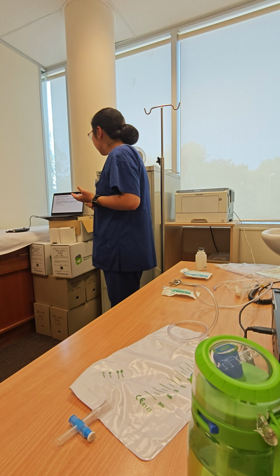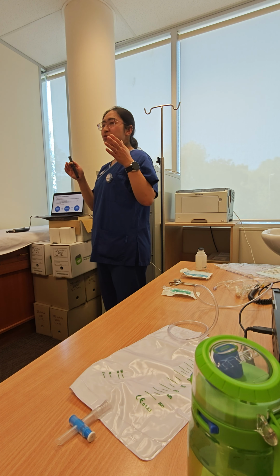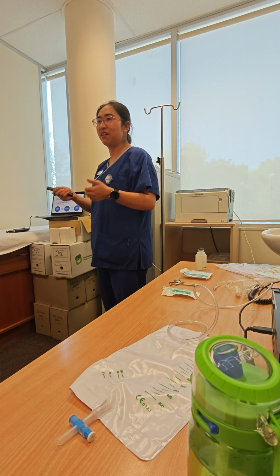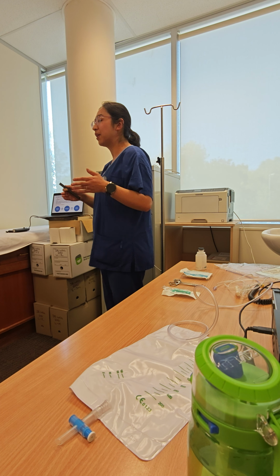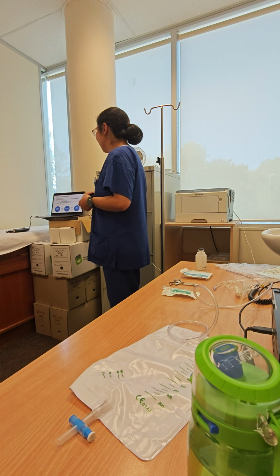That's the reason the cystogram is so important. If we do the cystogram and there's no leak, that means the surgeon did a really good job. But even if we find a leak in the bladder, it doesn't matter. The cystogram can guide the surgeon to make a treatment plan.